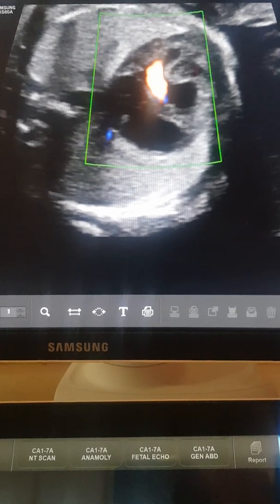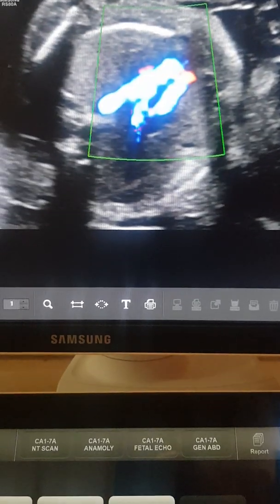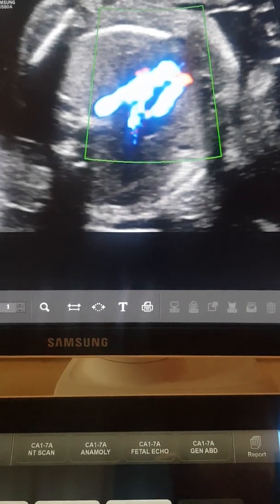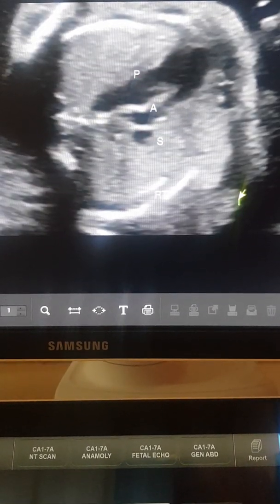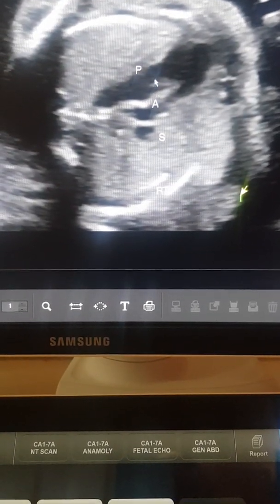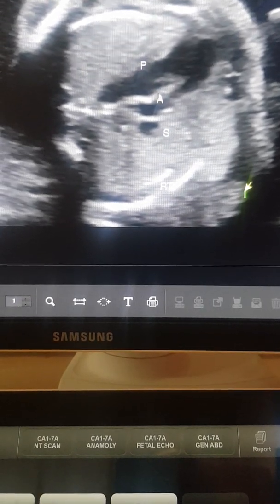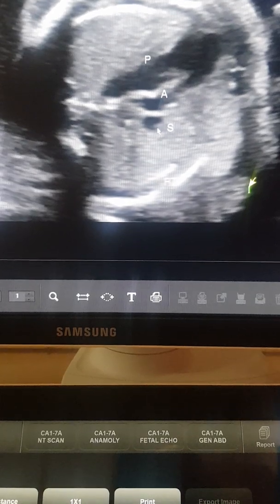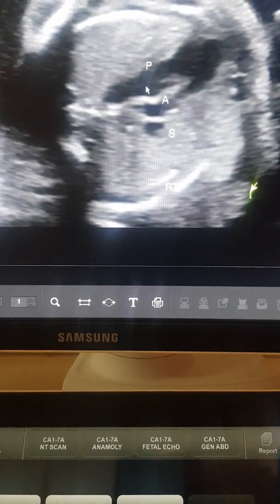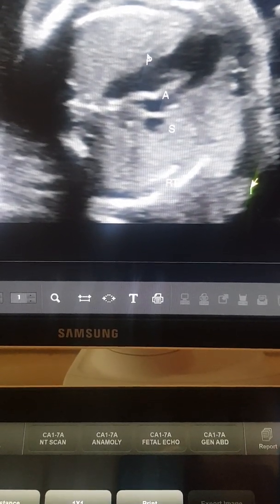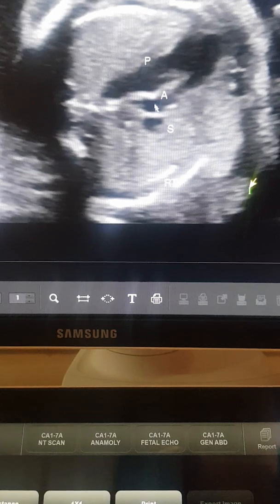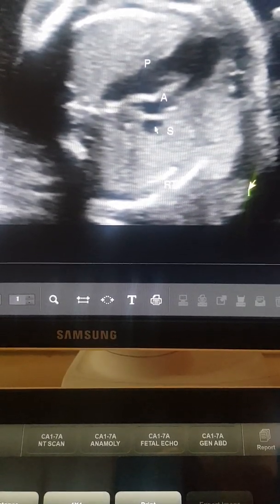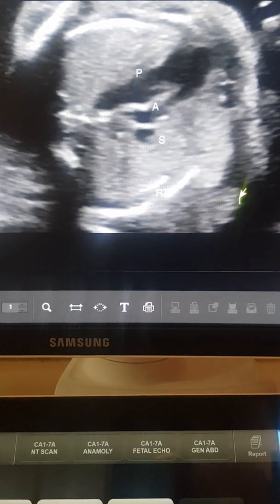With color Doppler, you can see the shunt across the ventricular septal defect where blood was going from the right ventricle to the left ventricle. The three-vessel view showed a large or normal-sized pulmonary artery, a smaller ascending aorta, and a normal SVC. The aorta, which is supposed to be larger or intermediate in size between the pulmonary artery and SVC, was only the size of the SVC.